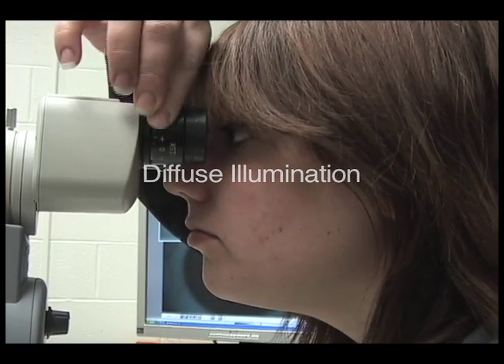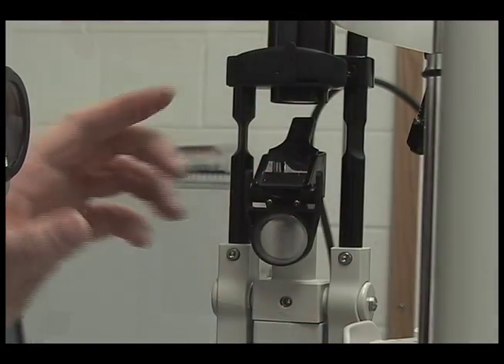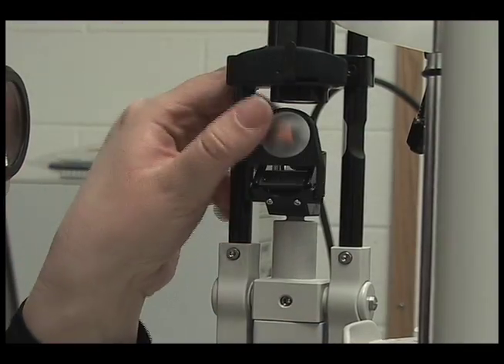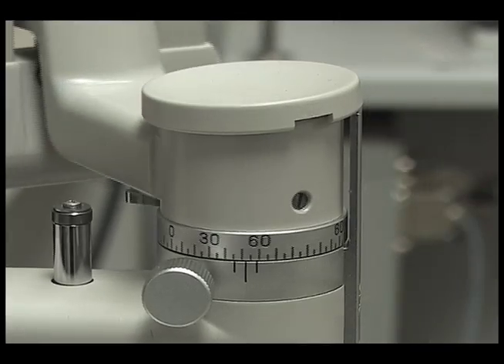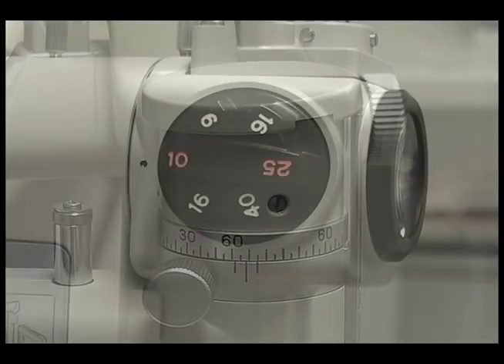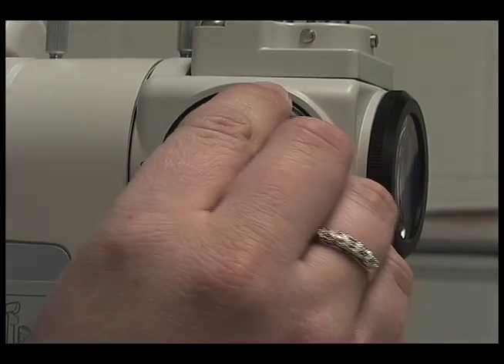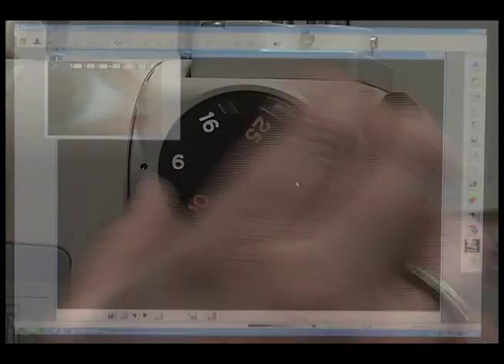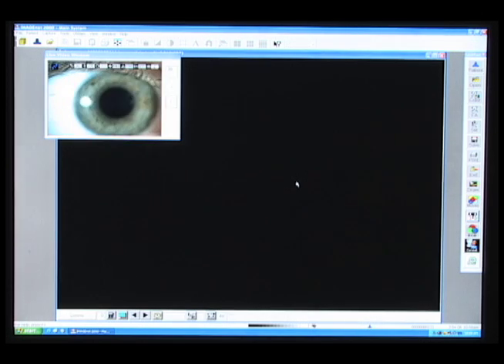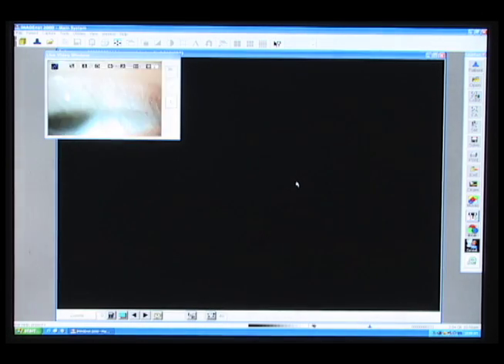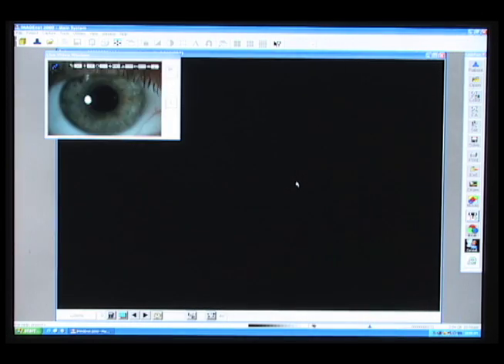To make diffused lighting, flip up the diffuser, turn the light up slowly, and adjust the width and height of the beam to best illuminate the subject. The light should be flat and evenly distributed on the subject.